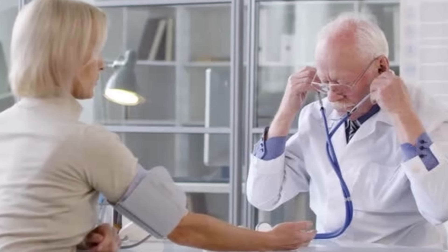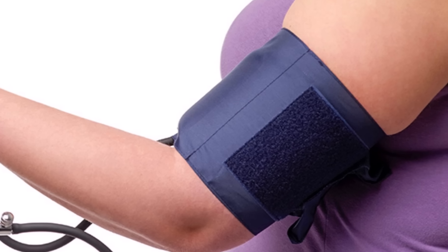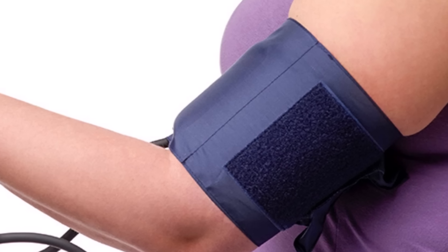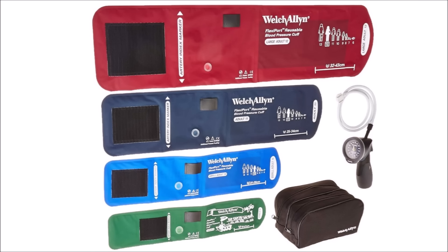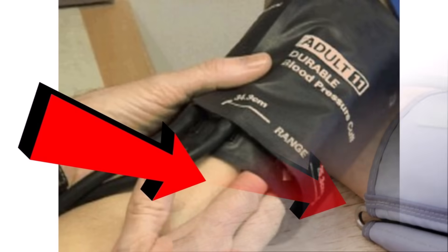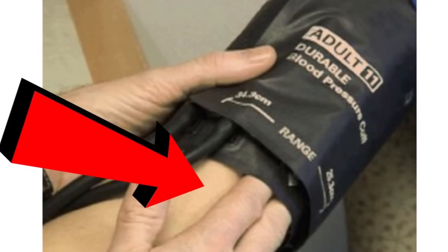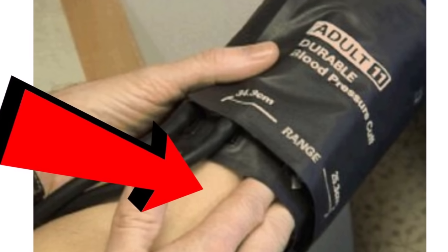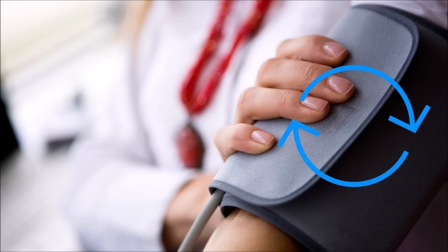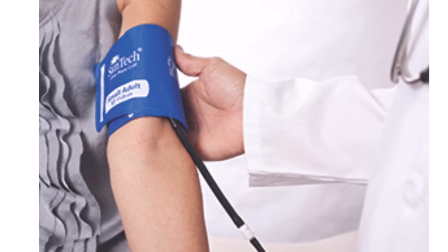The second reason you may get a false reading is a cuff that is too loose or too tight after you wrap it around your arm. Even if you have the right cuff size, it's possible you may be making this mistake. When secured, the cuff should be tight enough to fit fingers between the cuff and your arm. It shouldn't be so loose that it moves around, or so tight that you can't slip a finger under it.